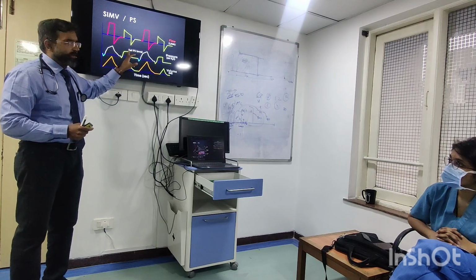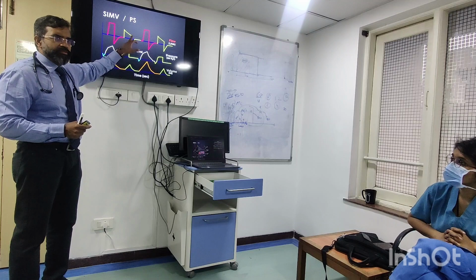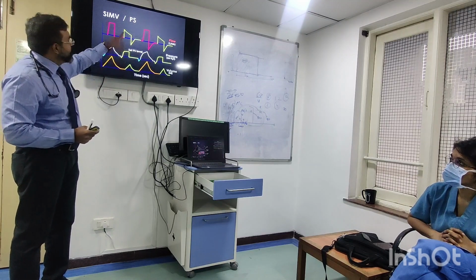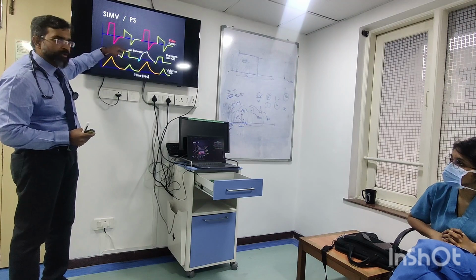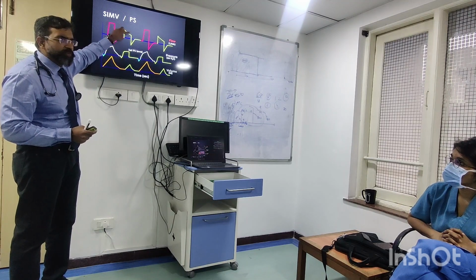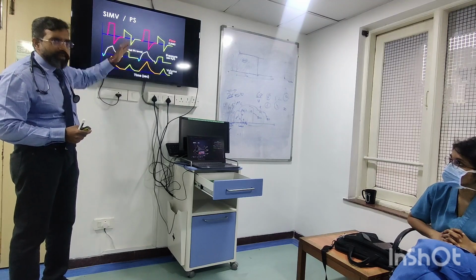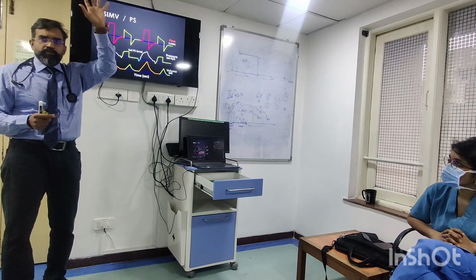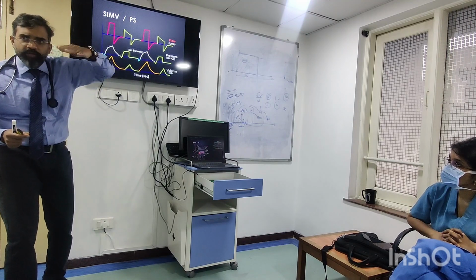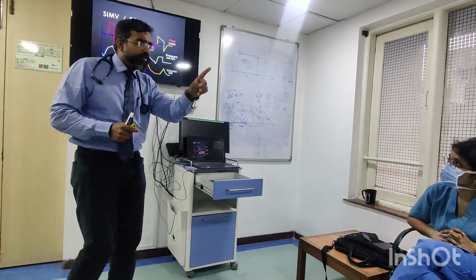So you might wonder, why did this happen? It is trying to maintain that pressure. It went up first so that it could reach a certain level, and then it was maintaining it at that pressure. That's why the flow is decelerating. It doesn't require so much pressure. It went up and then it reduces so that it is maintained at this pressure. The pressure went very high first, then it is maintained, and to maintain it, obviously the flow is going to decrease because a lot of pressure has already gone inside. Right? So you have a set limit, and the limit is your pressure.